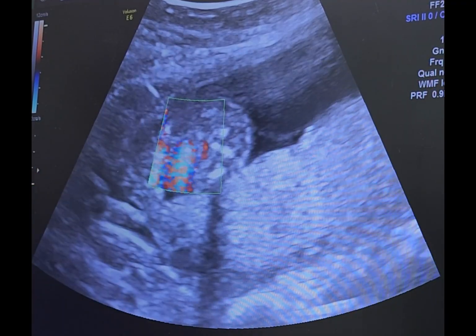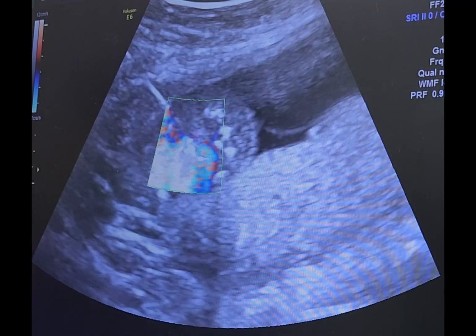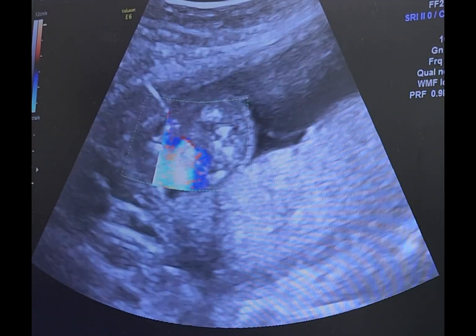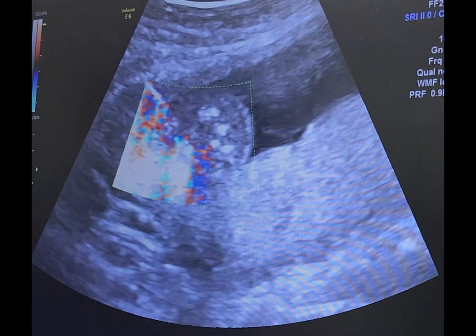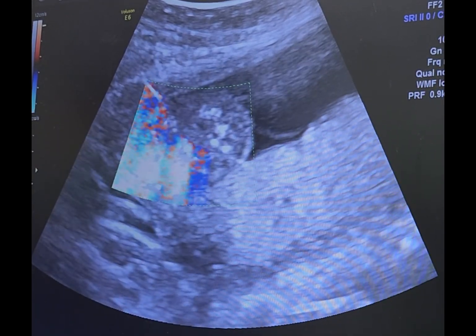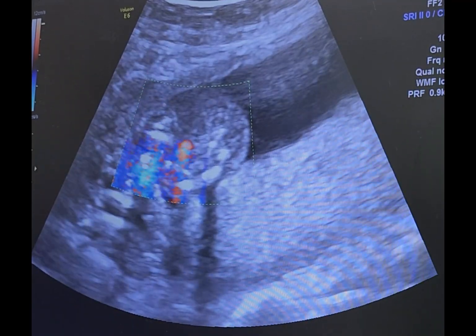The ablation is started. You can see how there is intense Doppler signal at the tip of the needle. We use initially 50 watts for 1 minute, then 70 watts for 2 minutes in the first cycle.